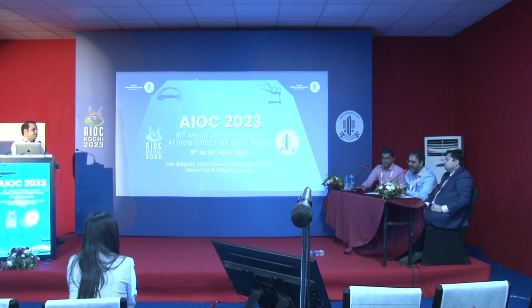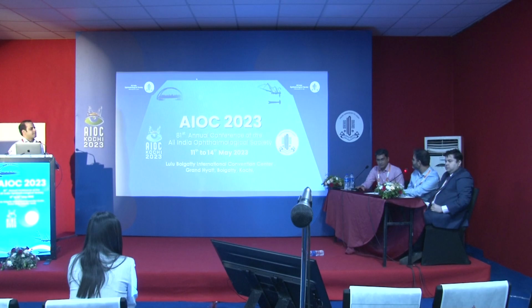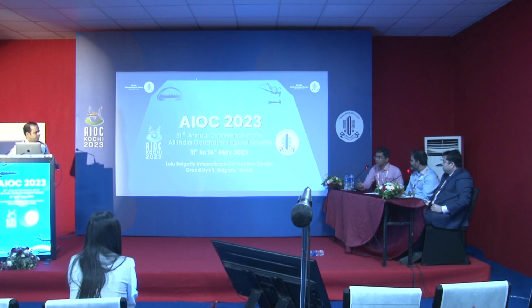And if we are taking the cyst out and it bursts, then it's difficult to manage. So the idea is that it should not burst. I have seen Dr. Mahesh operating such cases, not so posterior but near the equator and just posterior also, removing it transclerally, so not even doing a vitrectomy. But yes, we have seen him doing vitrectomy also.